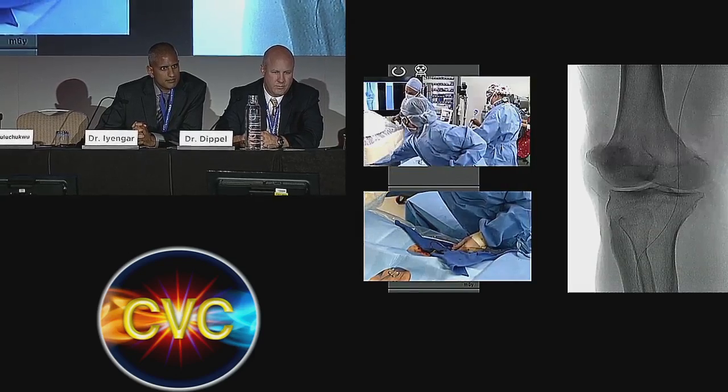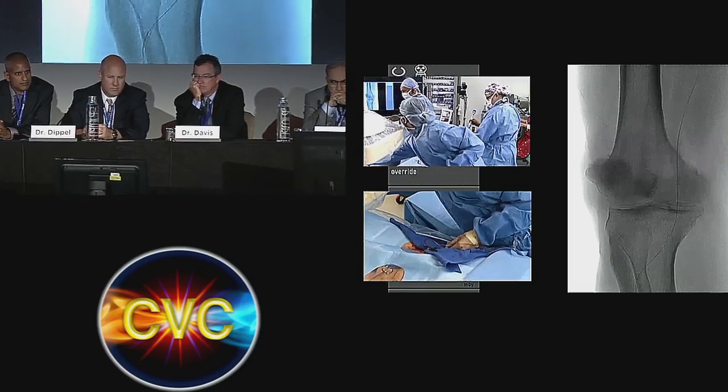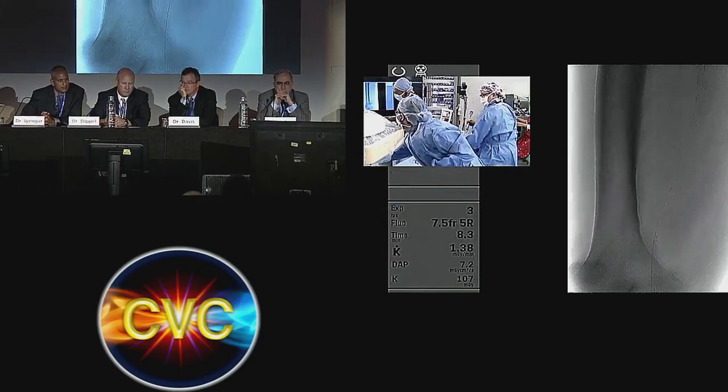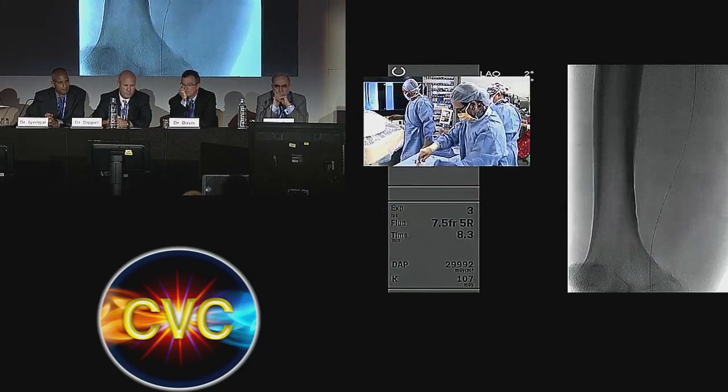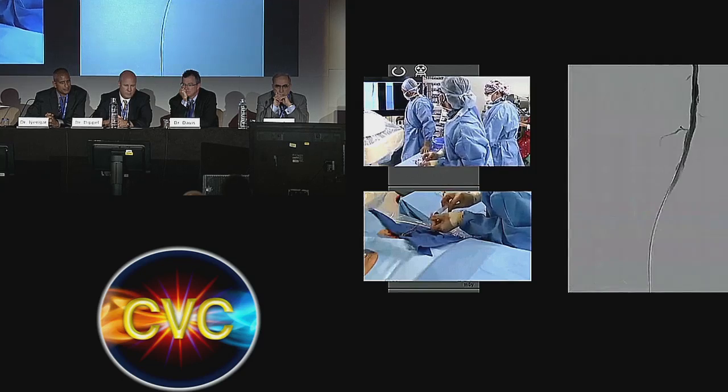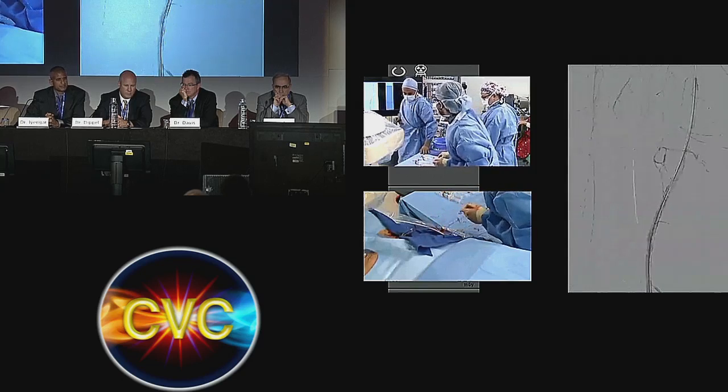In that case, the question changes, as was properly mentioned, and maybe I will give a little more consideration to treating the AT for better outflow for that stent. But in the primary instance, I will not treat the tibial disease just based on the patient's symptoms.